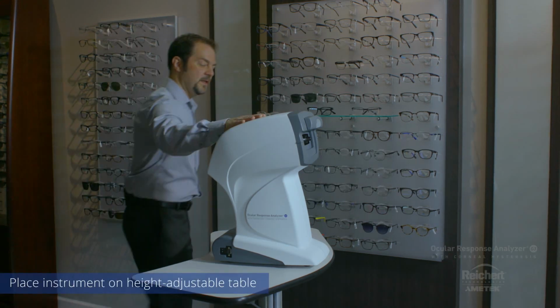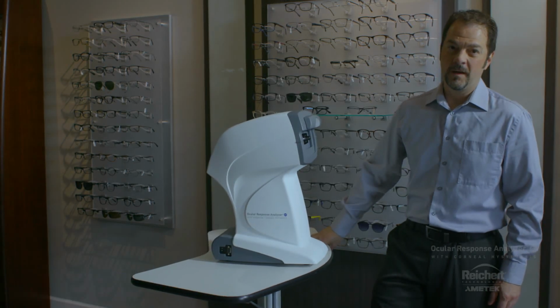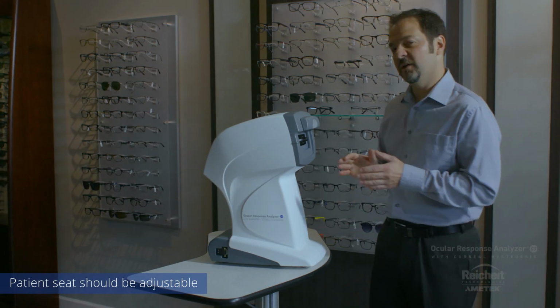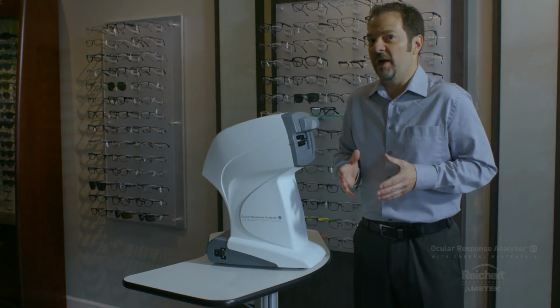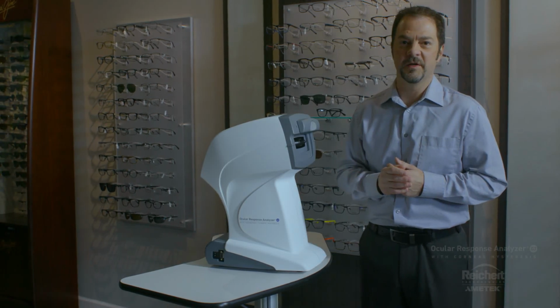The Ocular Response Analyzer should be positioned on an adjustable height instrument table. In addition, it's a good idea to have an adjustable height patient seat. It's really important that the patient can get comfortably in front of the instrument at the proper height. The patient shouldn't need to strain to reach the instrument or crouch down to get in front of the instrument, as posture can affect the measurement values that the device delivers.